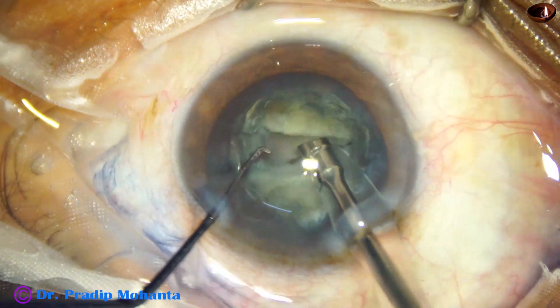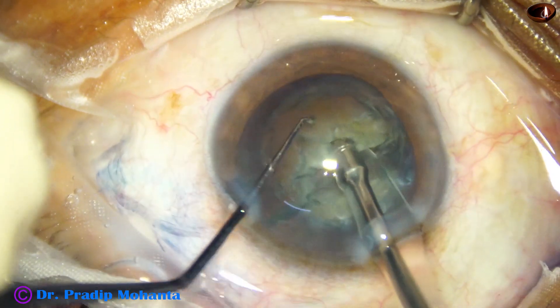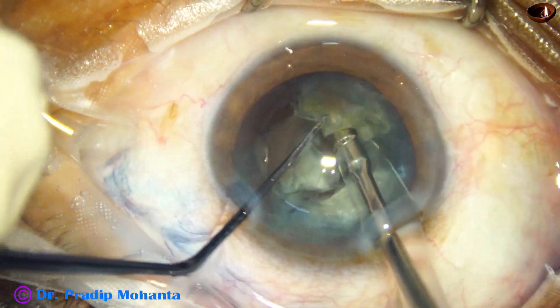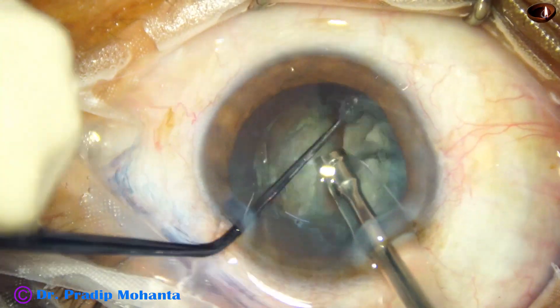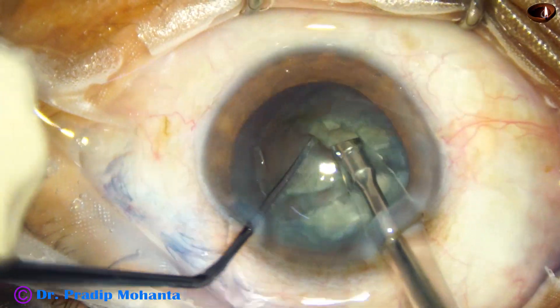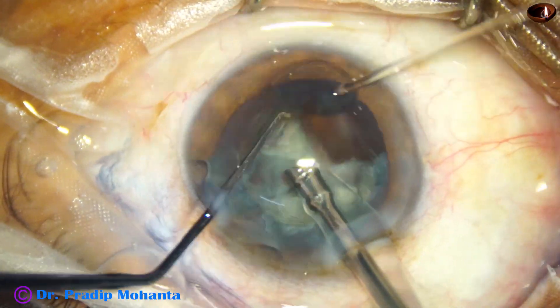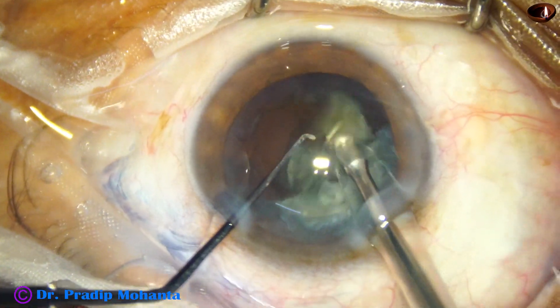Each heminucleus is held at the middle part — not at the upper part, but in the middle — and it is chopped by the left hand instrument. Any chopper can be used. Each nuclear piece is then emulsified.